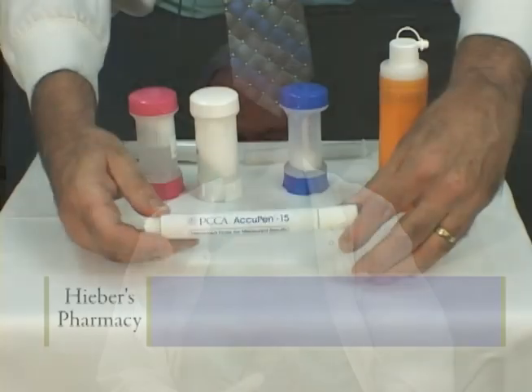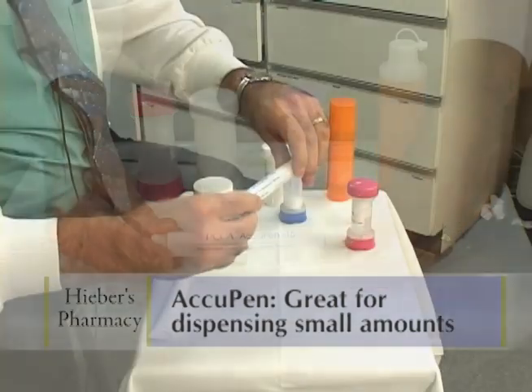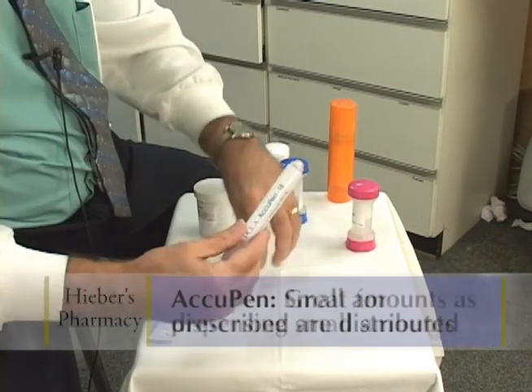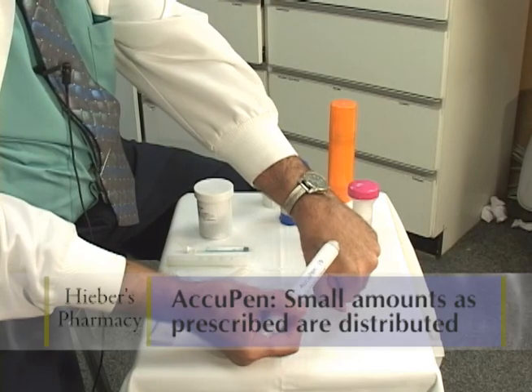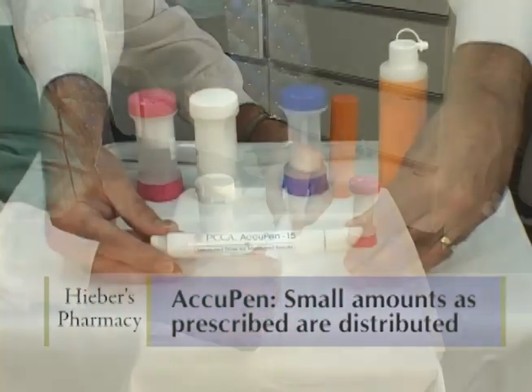For a small quantity of cream we have the Acupen, and this delivers 0.12 mls per each pump, each actuation. So it's a very little bit of cream, but you're getting the amount of medication that the doctor prescribed. We do the calculations for you.